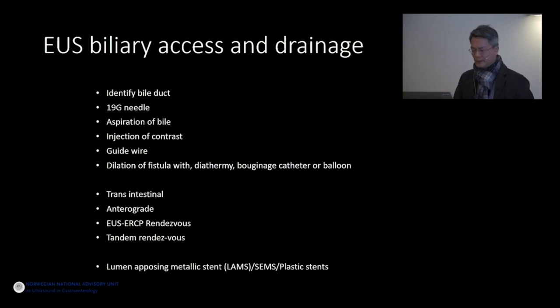You can do transintestinal drainage directly, you can do antegrade drainage, you can do rendezvous procedures, and then recently also a procedure we tested here called the tandem rendezvous. I will show you later. And then you can use any stents you want to drain further.